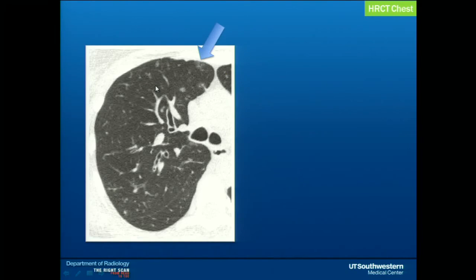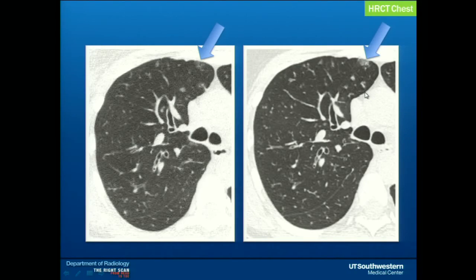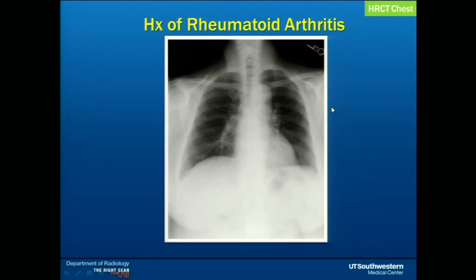So this image is showing a routine CT scan of the chest. There is a ground glass nodule, ill-defined, but look at how beautiful this image is. It is very sharp and crisp and shows the nodule really nicely. We all know that fibrotic lung disease has an association with collagen vascular disease and autoimmune disease, so I'm going to cite some examples to highlight the importance.